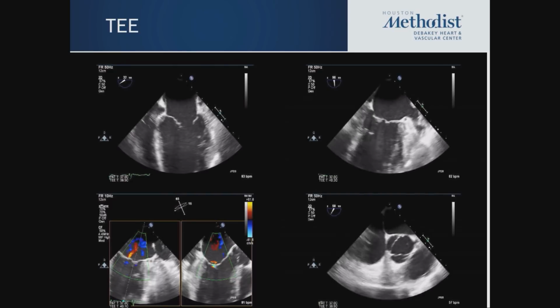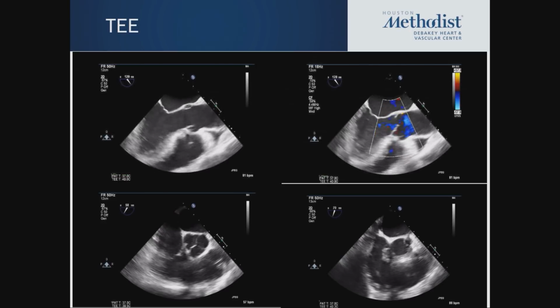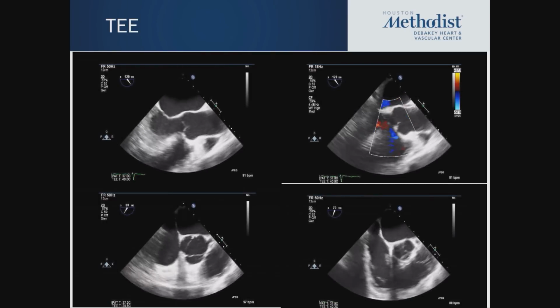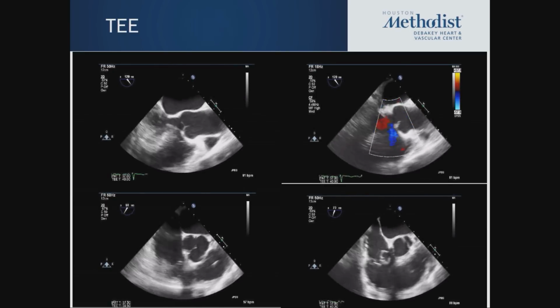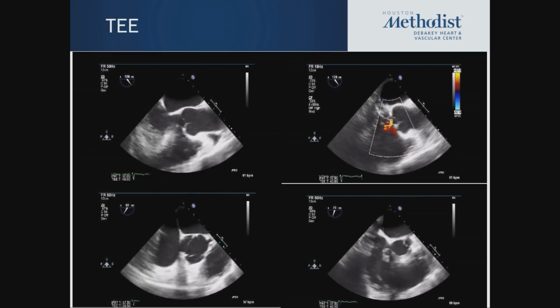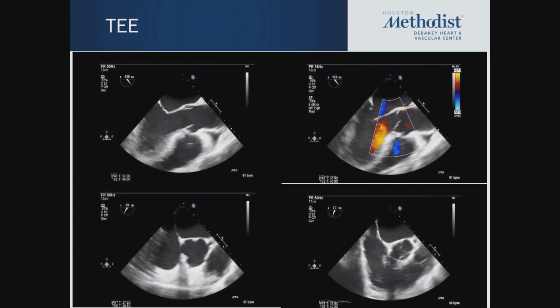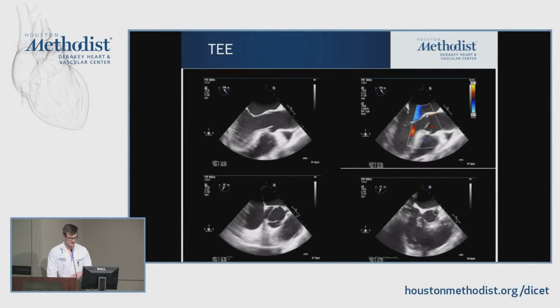The aortic valve on the short axis also trileaflet, not thickened. So far, no masses seen. LVOT view, also normal appearance of the aortic valve with no significant regurgitation there. However, on the right side, pulmonic valve is overall well seen and no significant abnormalities seen on the pulmonic valve, but the tricuspid valve looks a little bit abnormal. Mainly the septal leaflet of the tricuspid valve looks like what is called a windsock, a little bit tilted toward the atrium. We'll focus on the tricuspid valve in just a few seconds.